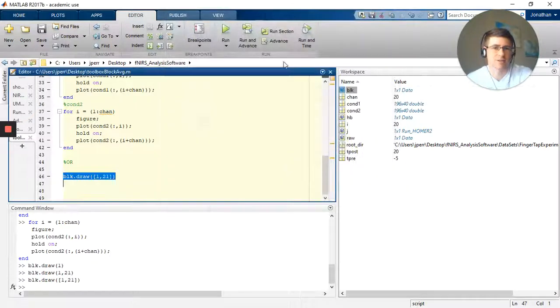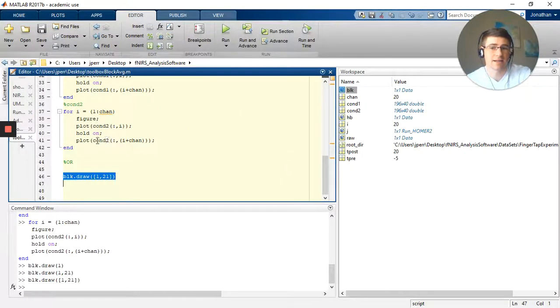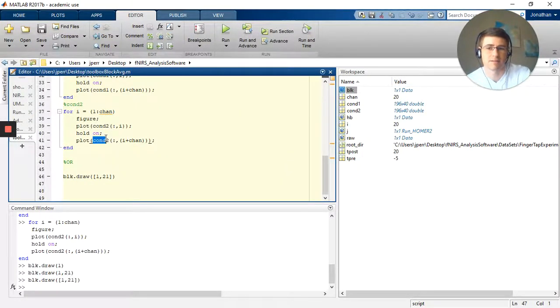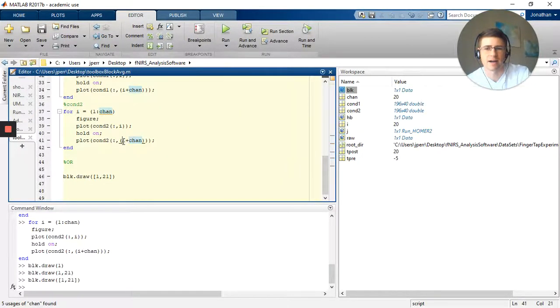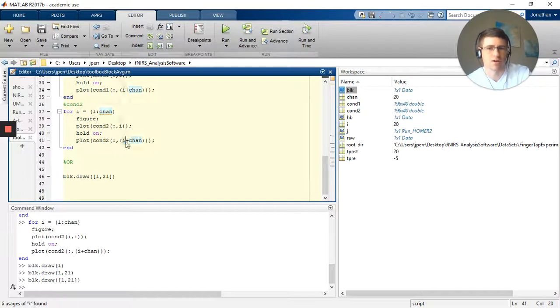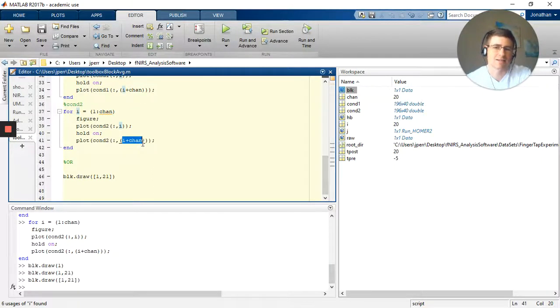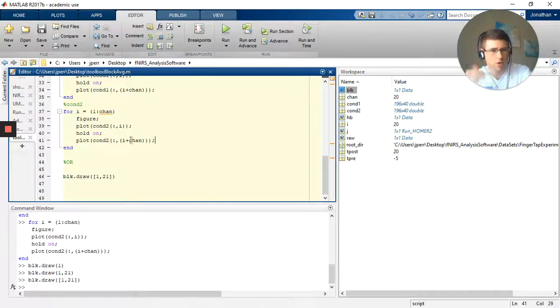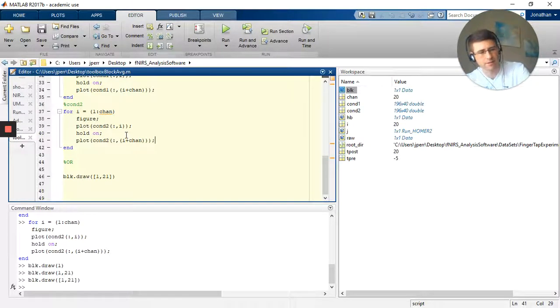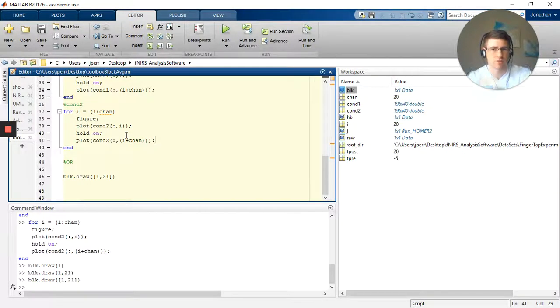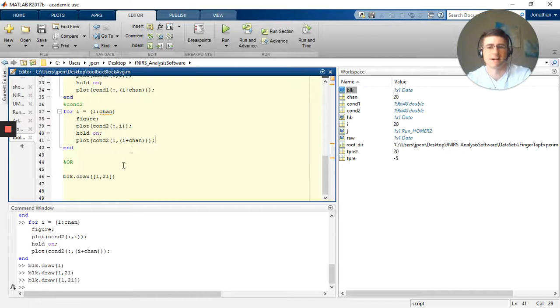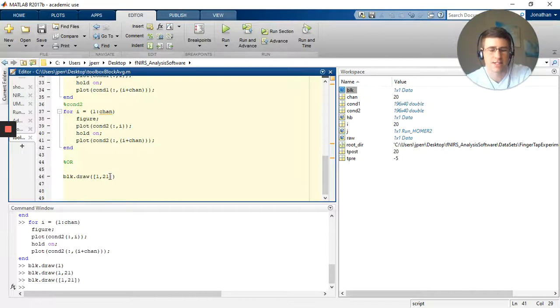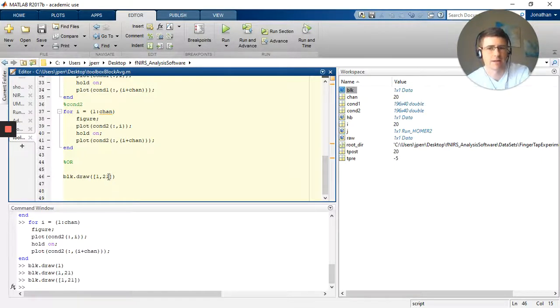So here we had i, which was the channel number, plus whatever channel it was. So it was plotting both the channel and then 20 past the channel, which would have been the matching deoxyhemoglobin. But the question is how do I get that? So that's condition one, great. But how do I get condition two? I can't just do a third dimension, it doesn't work in the toolbox.